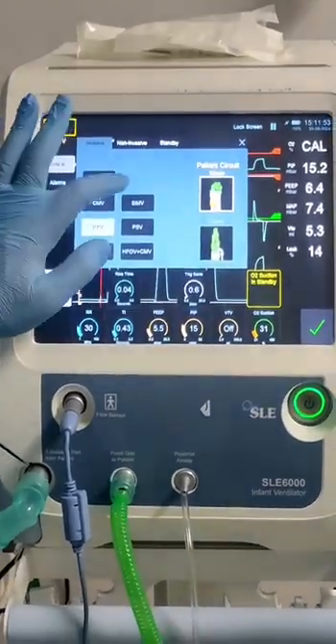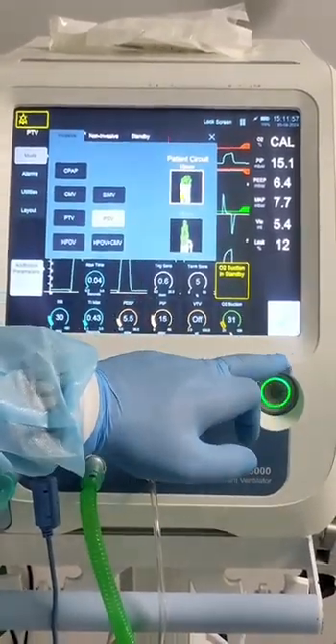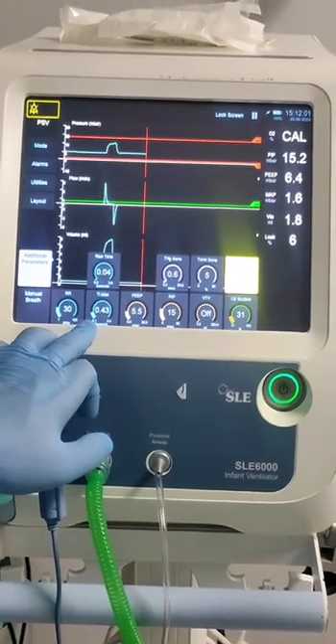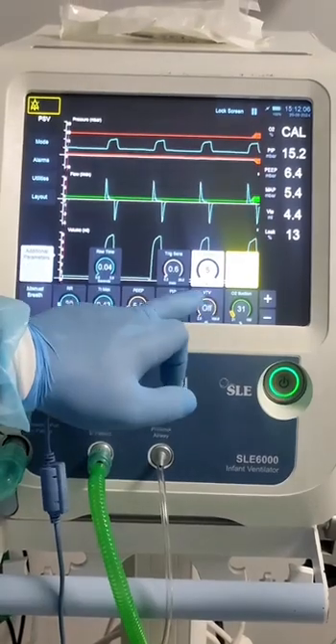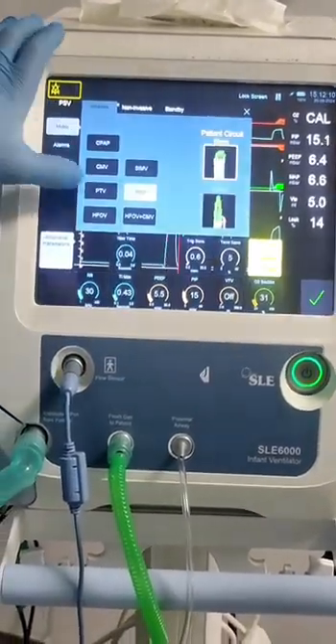For pressure support ventilation, the parameters are: respiratory rate, inspiratory time max, peak inspiratory pressure, termination sensitivity, and rise time.